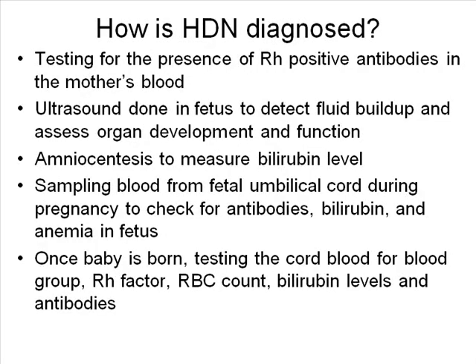All right. Remember, how do we actually diagnose this? We're going to get cord blood. And how do you do cord blood, ABO, and DAT testing? You want to wash it because it has Wharton's jelly. So you want to wash it a good 6 times to make sure you get all of that out because it can interfere with your direct Coombs.